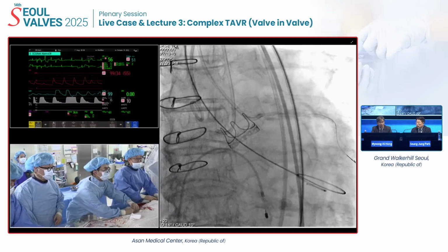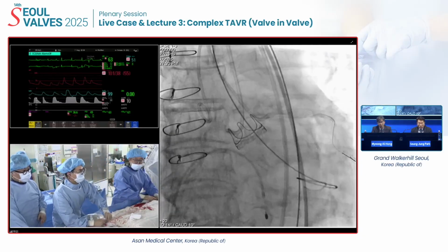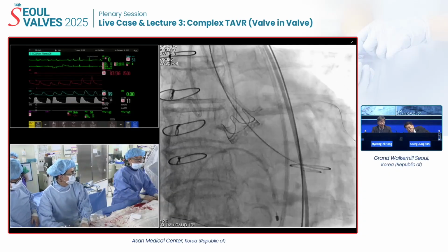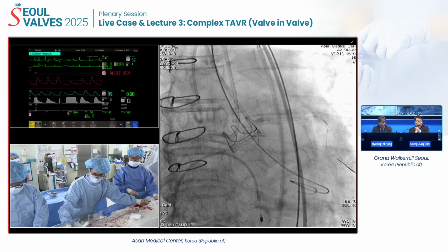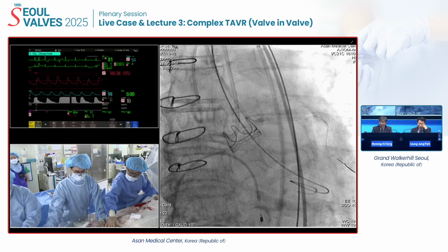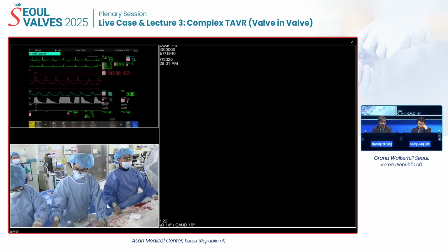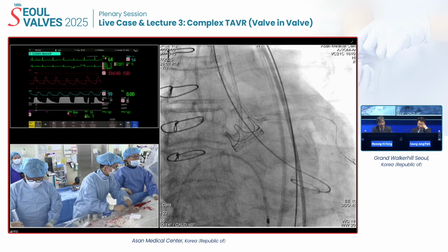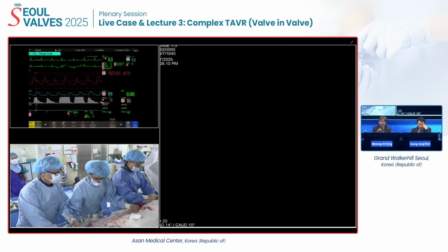Okay. In my personal experience, especially in valve degeneration, this is 14 years and the valve area is 0.5, very narrow. Yes. In this kind of patient, the debris for cerebral protection is a huge size, not a particle. The characteristic of the debris is degenerated tissue, not calcium.